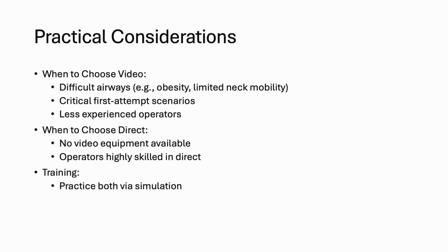Practical considerations. So, when do we use each? Video laryngoscopy is ideal for difficult airways. Think obesity or limited neck mobility, or when that first attempt is critical, like in unstable patients. It's also forgiving for less experienced operators.